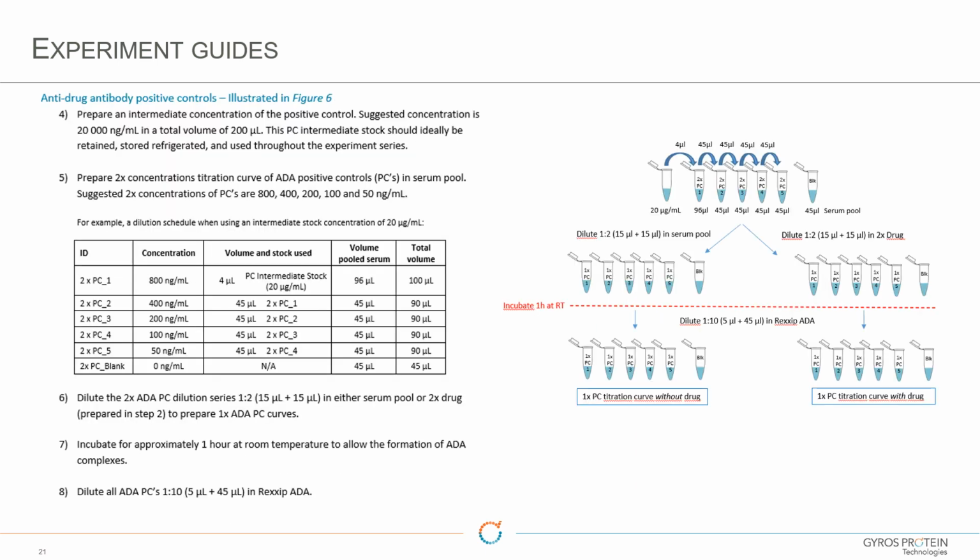So in the experiment guide, it actually gives you an indication of how to set the experiment up. It gives you a pipetting and dilution scheme, showing you how to prepare your positive controls, but also how to prepare your drug concentrations.